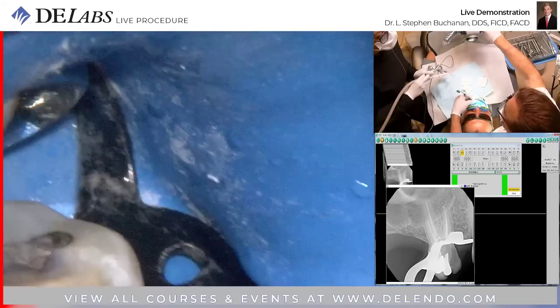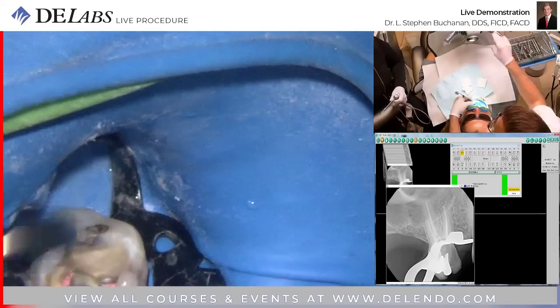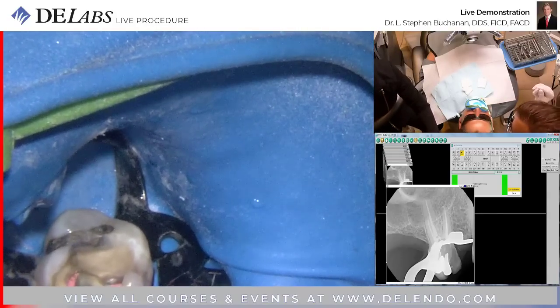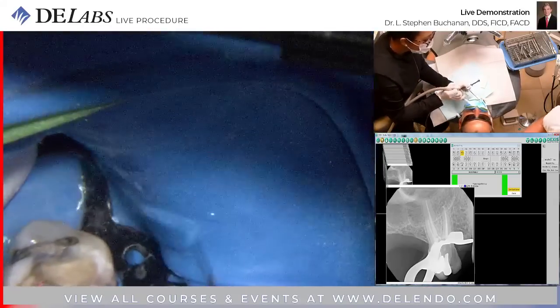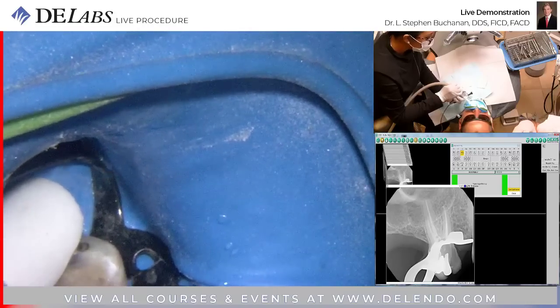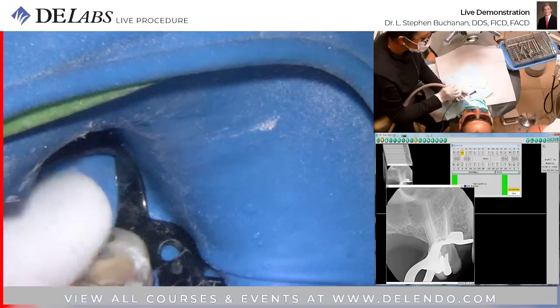So I think we're ready to put a little glass ionomer in. Can I watch a little bit more? Yes, please. So most of my referring dentists are exceptional dentists. We live in a town where people aren't around for very long. And so most of them want me to go ahead and seal the pulp chamber floor and the orifices with air abrasion and glass ionomer. And then I'd go ahead and temporize it and they do the buildup.